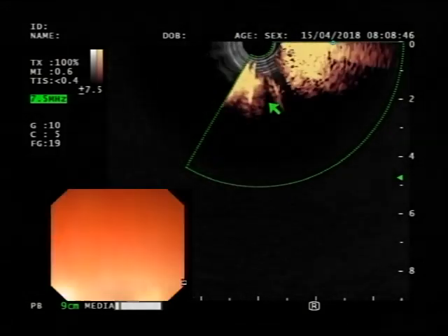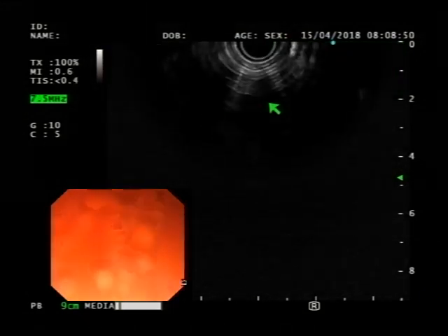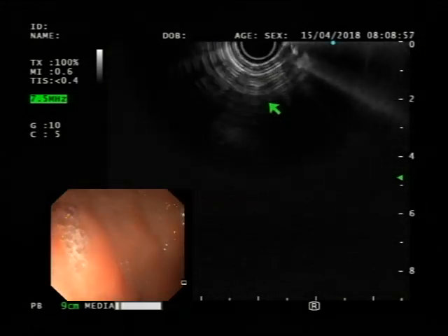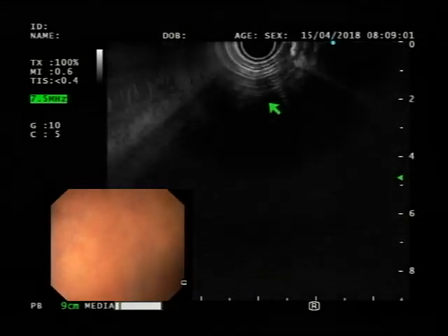Big. Clean the lens a little so we can tell where we are going, okay? So when you go into the bulb, inflate. Okay, go into the bulb. You are still in the stomach. Okay, go. Big wheel towards you, right there.